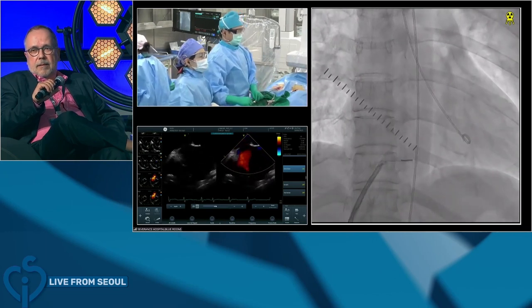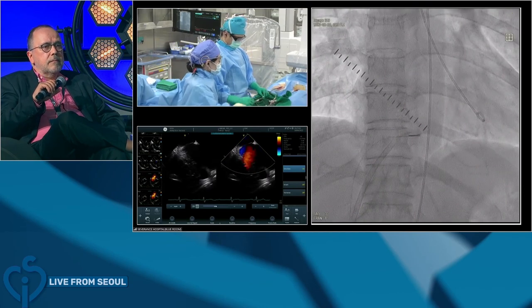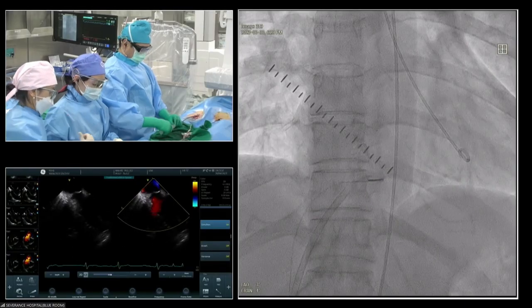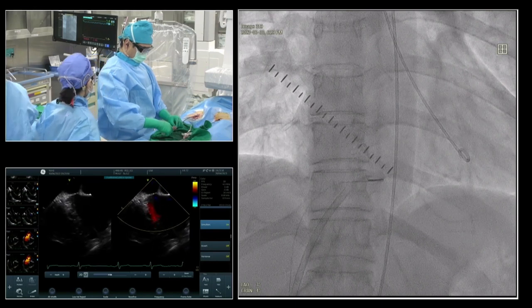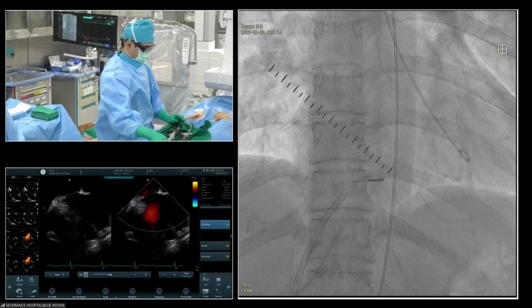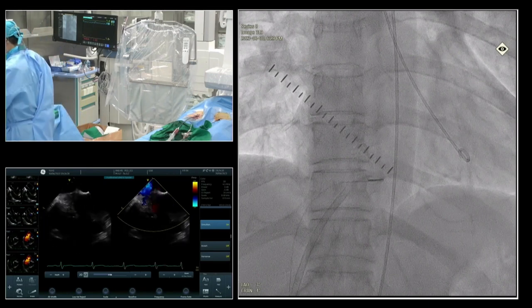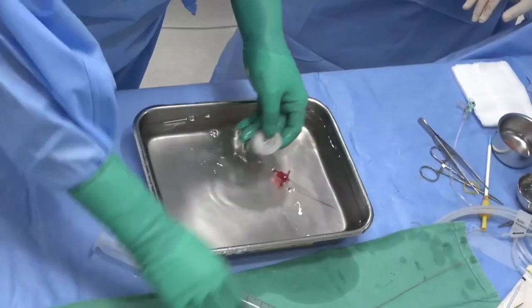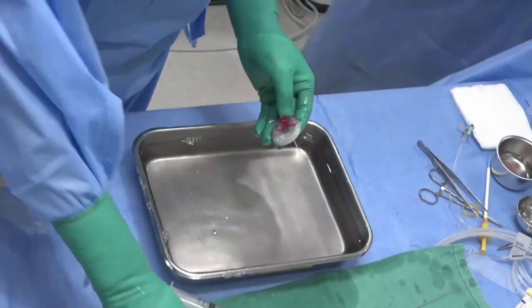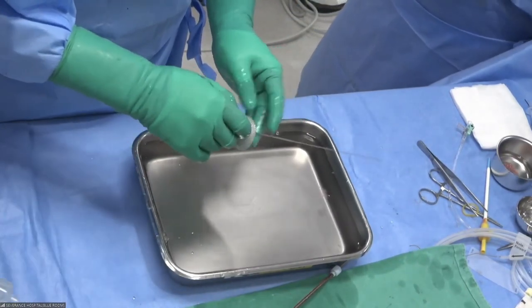Peter, can I ask a quick question? It's Gareth Morgan over here to your right. I wonder whether, if there are reasons to keep this device and not upsize, a balloon deployment might help stabilize the left disc on the aorta and make sure you can't get a splay on the aorta. I probably would use a bigger device, but if there's a good reason to keep this device, a balloon deployment technique might allow you to stabilize it across the aorta. Just wondering. Yeah, I think it's a good idea.